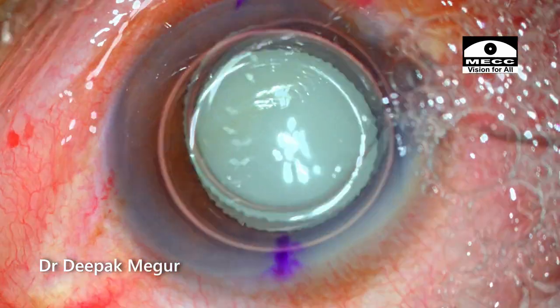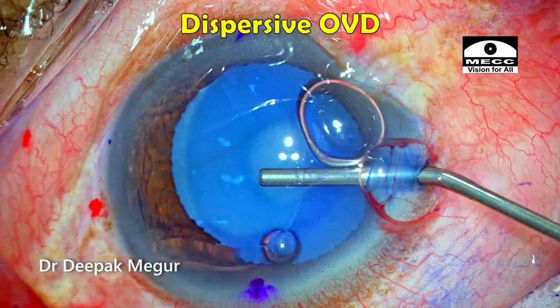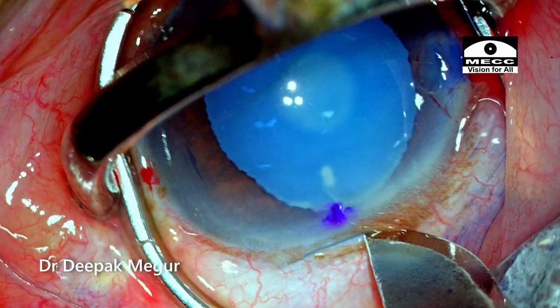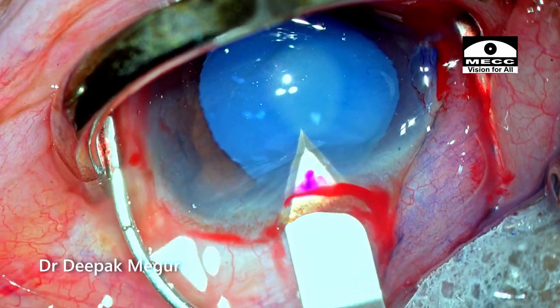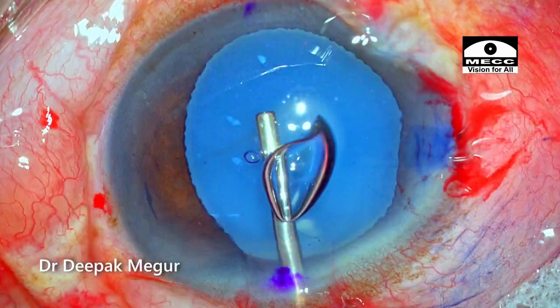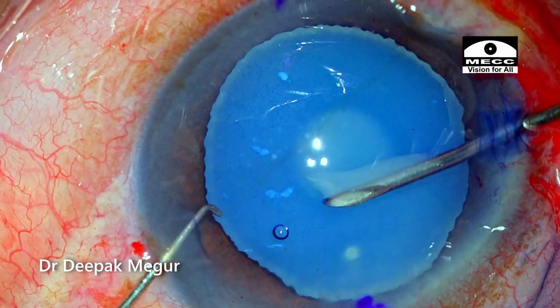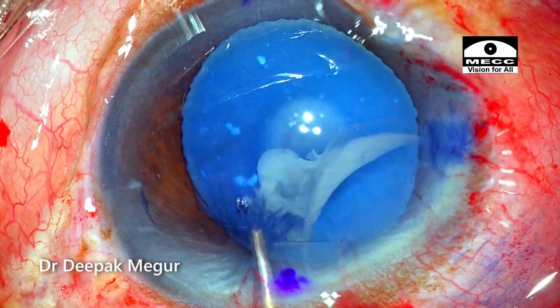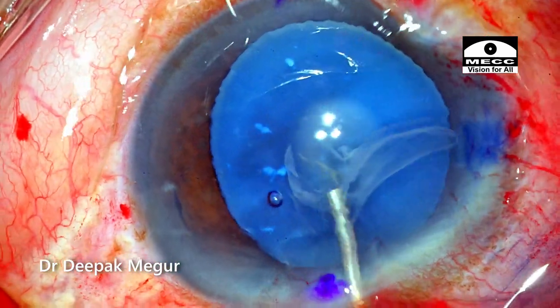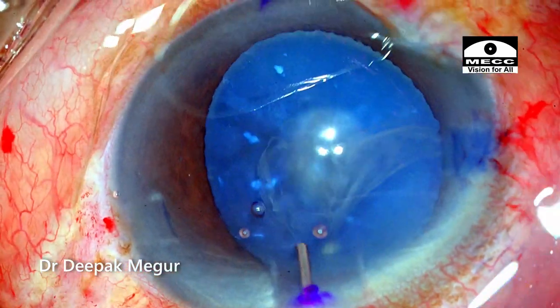The side ports are made, the capsule is stained, and OVD is put into the anterior chamber. A 2.8 millimeter incision on the steep axis is planned and performed. As I puncture the anterior capsule, the liquid cortex is escaping out. Gentle irrigation ensures that the liquid cortex is washed out so that visualization will be better.